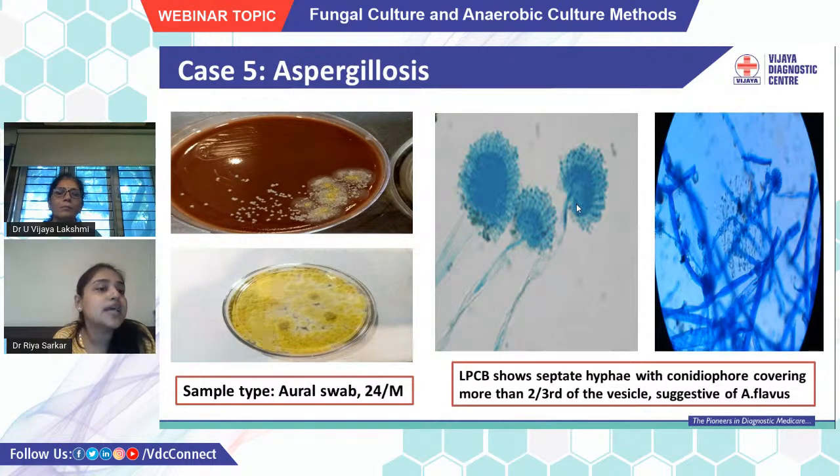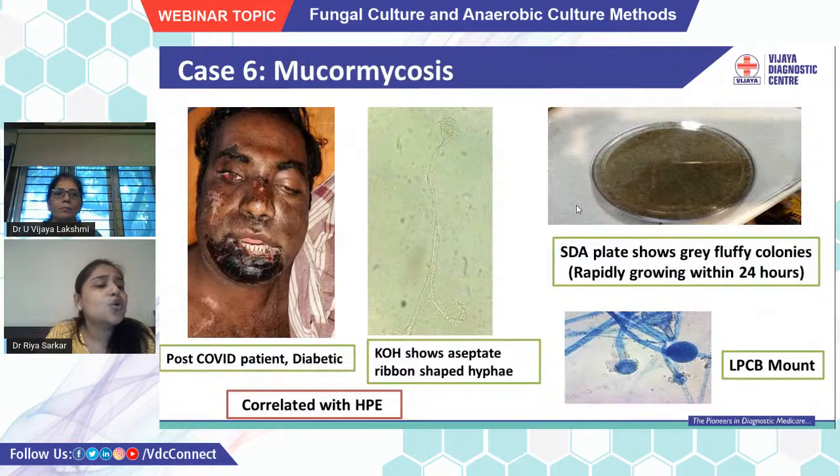Hence, we reported this as a dual infection of Candida albicans and Aspergillus flavus. A post-COVID hospitalized diabetic patient had given us a sample.